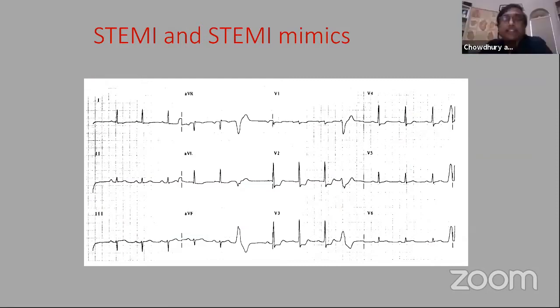Right. Thank you. Now, this is an EKG that was actually given by my EP friend. They also do on call and we are their backup. And the emergency room physician was upset, saying this is a STEMI, because they looked at the EKG by flipping it. And the EP guy is saying, we don't teach EKG by flipping the EKG, because if you flip this, it will be ST elevation, right? Look at the precordial leads. If you flip the EKG, you will see ST elevation. But in reality here, it is ST depression, right?